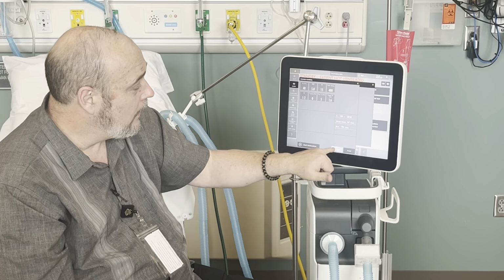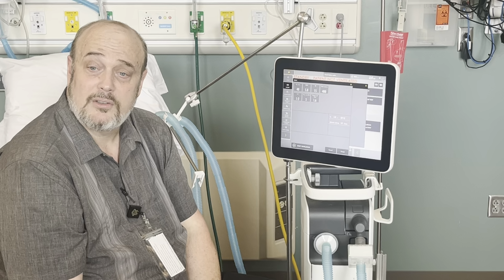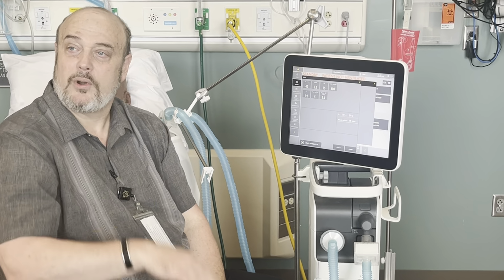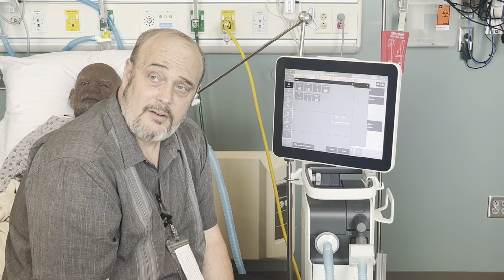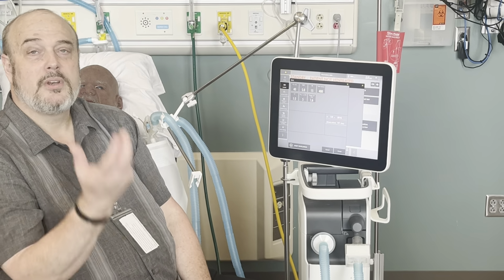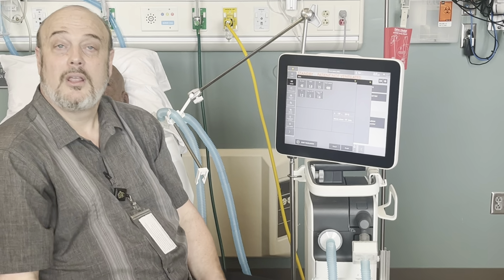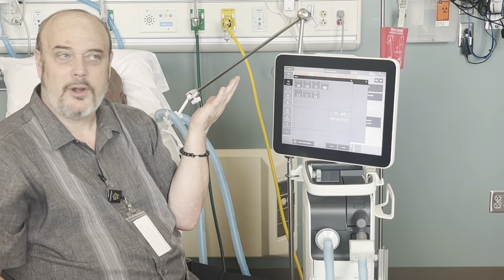Okay. And just to go ahead and cover PRVC, there is a negative thing to it, which we use quite often. So what it does is, like I said, it goes up and down with the pressure accordingly, right? Let's say I had the tidal volume set at 400, the patient's actually wanting 500 tidal volume. And so the patient's pulling in extra strong, deeper, going above 400. Guess what the machine says? Oh my God, this guy's doing great. We're giving him too much.